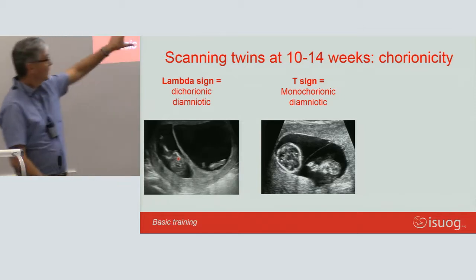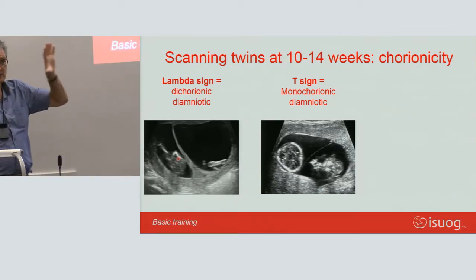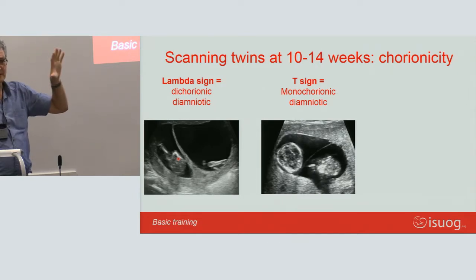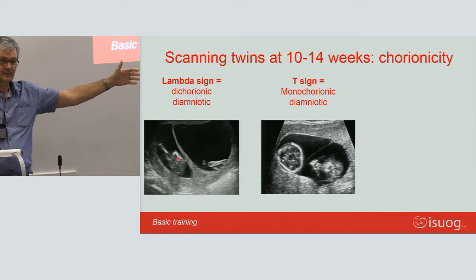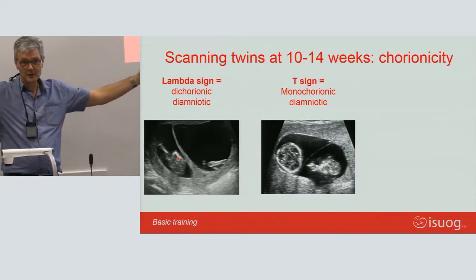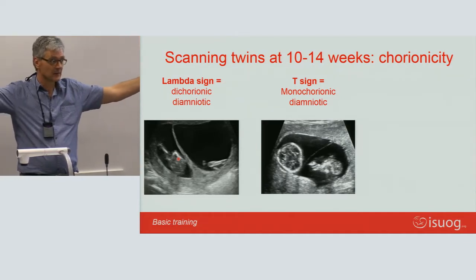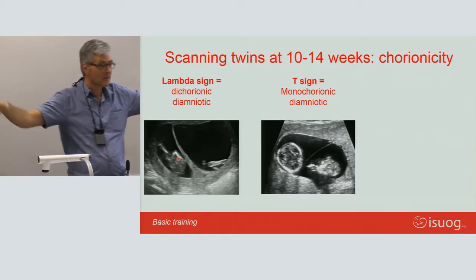Yes. So what you really want to know is on the screen. So basically 2 pictures that are burnt into your retina. And the one was that first great huge big crown rump length. And if you do a scan in 10, 12 weeks and you don't get a great huge big crown rump length like that, feel ashamed of yourself.